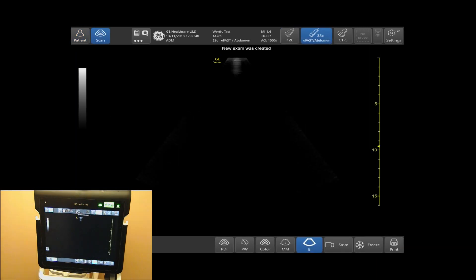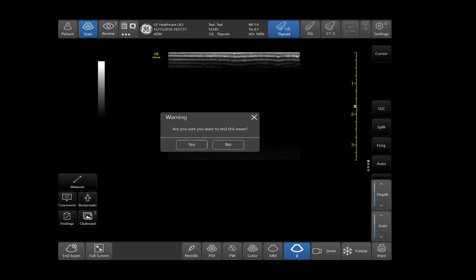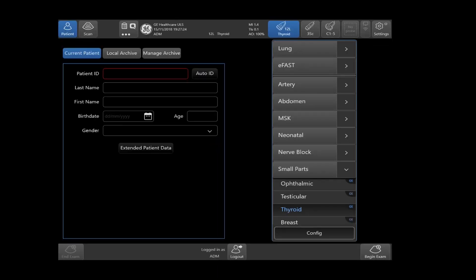You may now begin your exam. To end an exam, tap on end exam, located on the bottom left-hand side of your touch screen. Tap yes if you wish to end this exam. The exam is now ended.